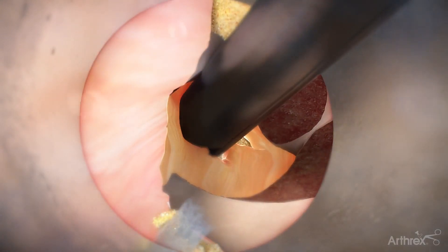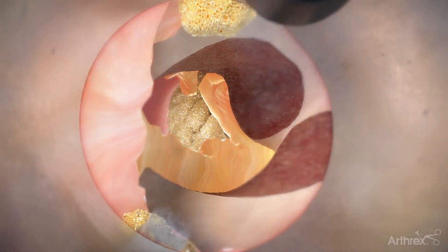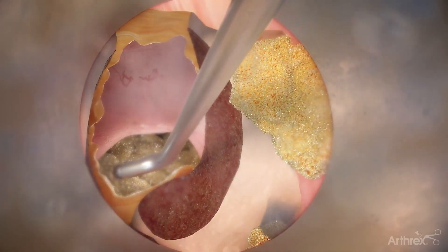Resect the ligament to view the lateral border of the dura. Once you have identified the lateral border of the dura, the nerve root can be identified.